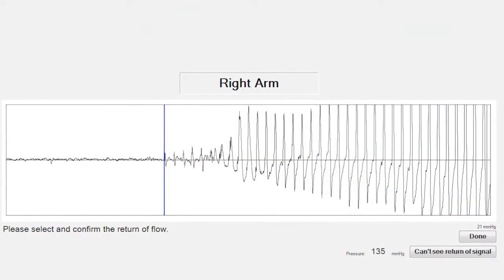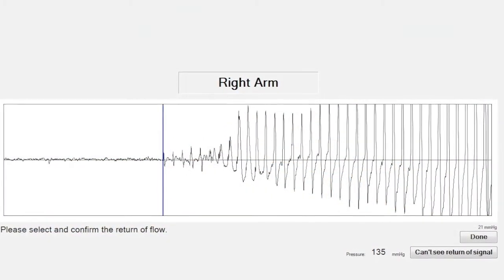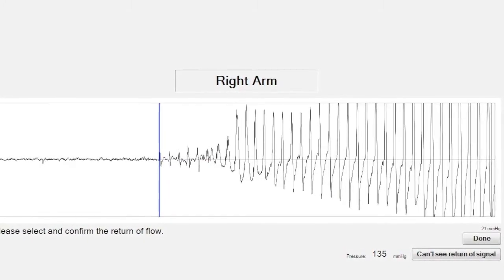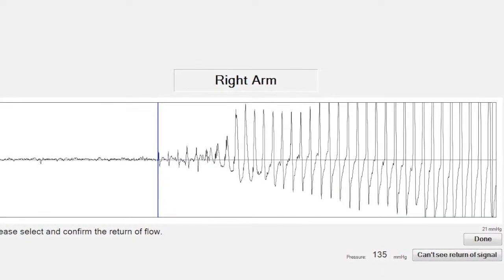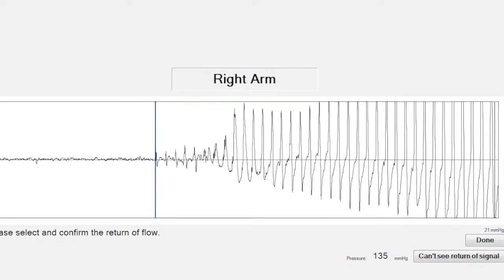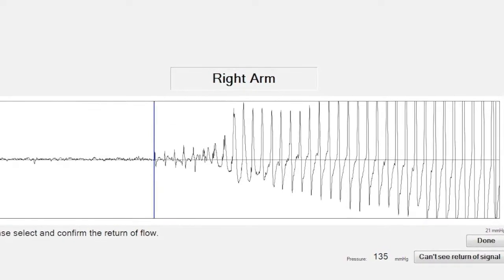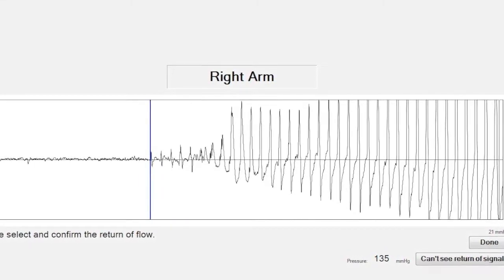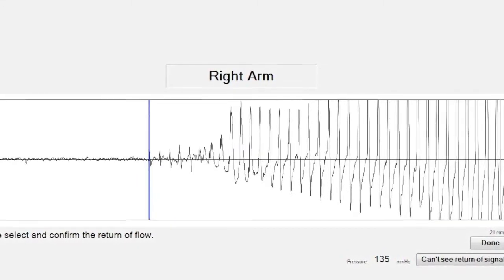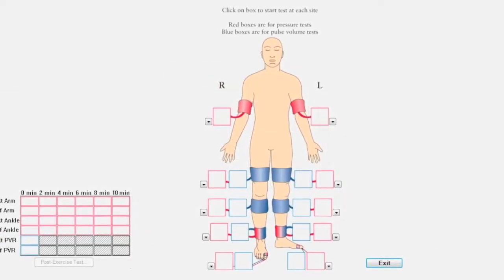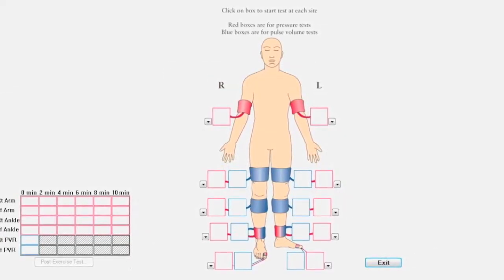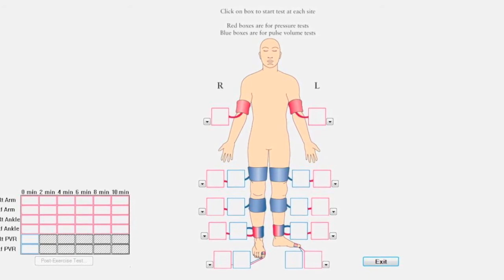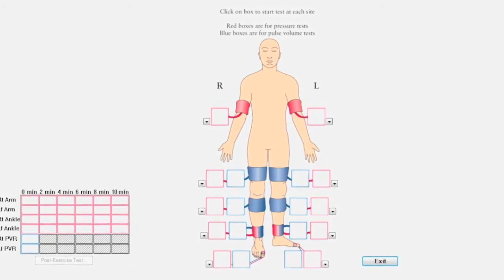After pressure has been released from the arm cuff, select and confirm the return of flow as detected by the PPG probe. This measurement provides additional information to support pressure accuracy. Click Save or press 1 on the keyboard to continue. The software will automatically advance to the next anatomical location as the test progresses.